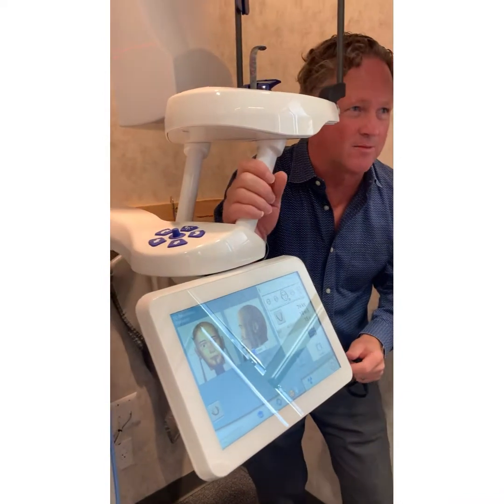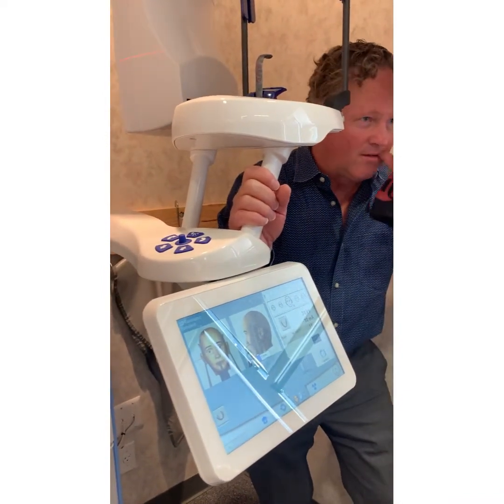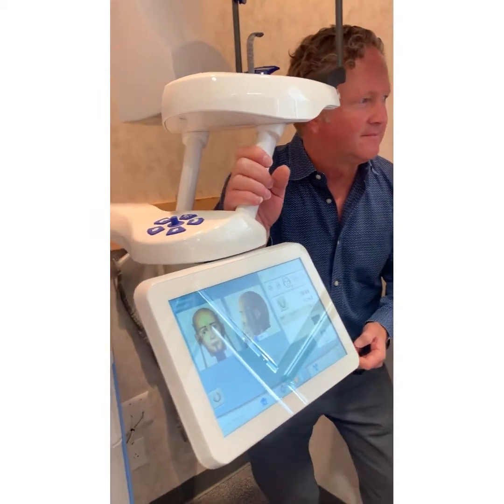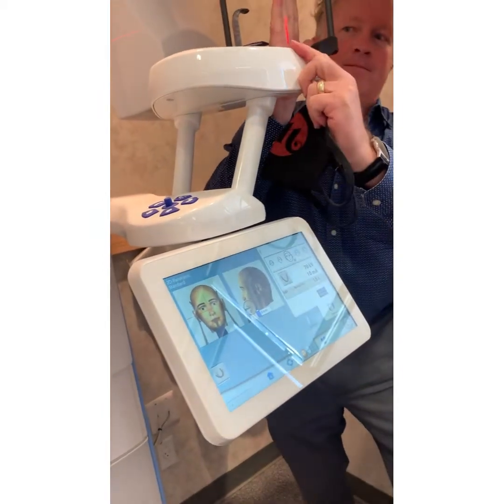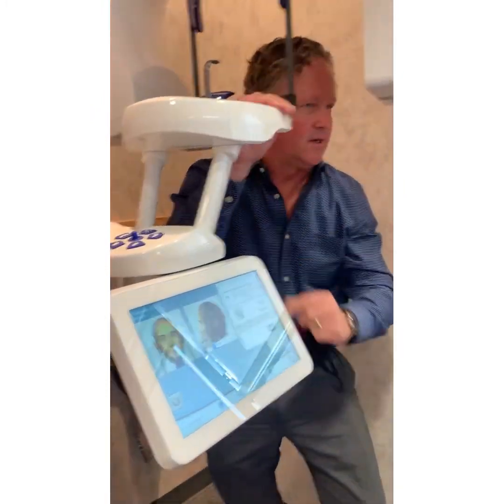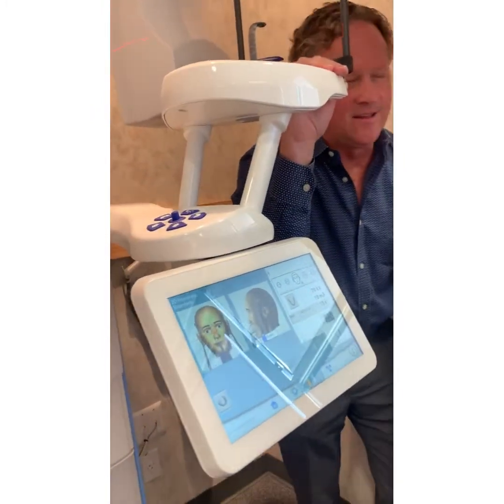If you have that patient where you ask them to smile and they kind of glove up and lift their lips, you can actually see that. Super important. So what are you making sure is between 10 and 11? The light, this one right here. The vertical. You know how the light here and the light there? This one right here is the one that you need to be between 10 and 11. And then the usual stuff ensues.